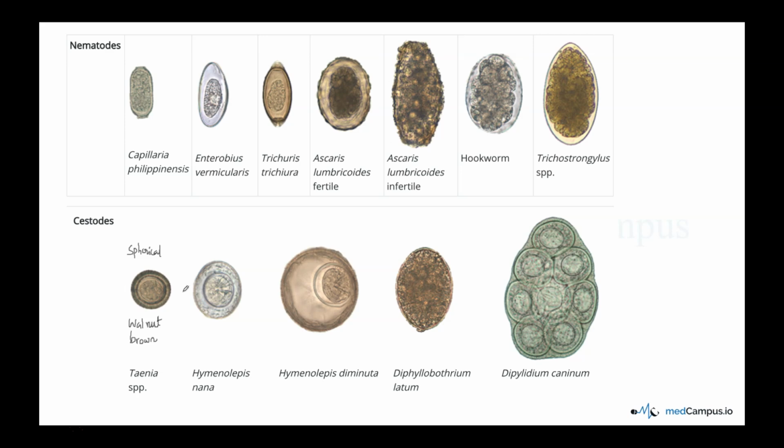One thing is clear, it has a very thick striated shell. Normal thick shell, thin shell, but here a thick striated shell, the special feature is added here.